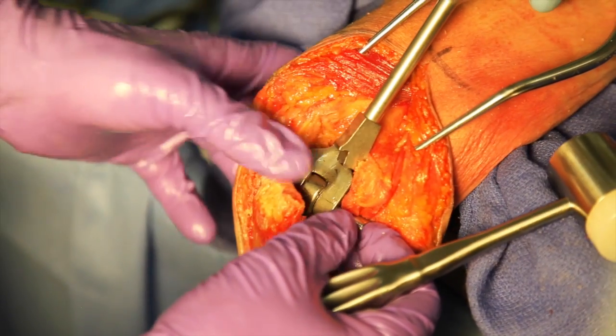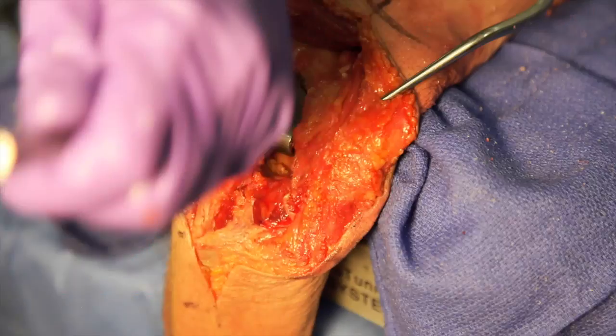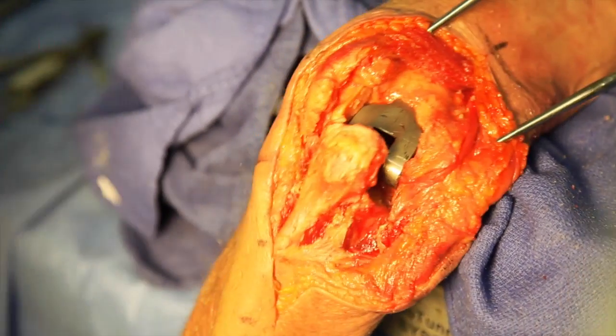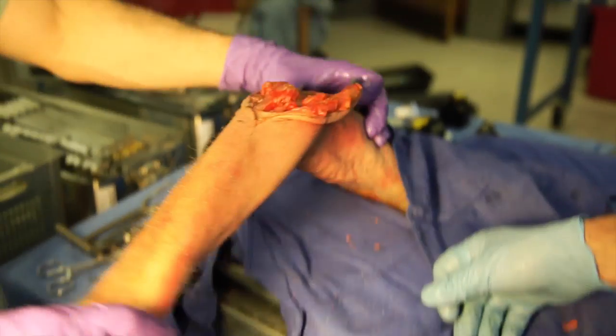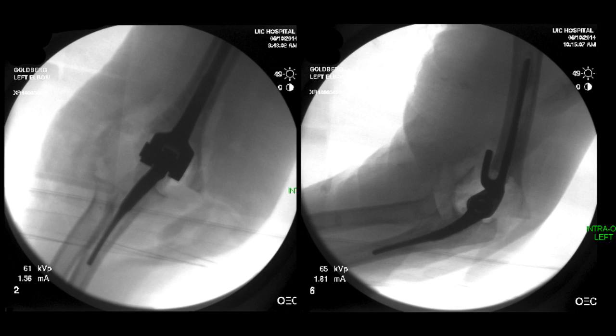Reduction of the joint is then performed. The components are aligned and the pin is inserted. The elbow is taken through a range of motion to assess if there are any areas of impingement. Intraoperative fluoroscopy can be performed to ensure adequate sizing and positioning of components.